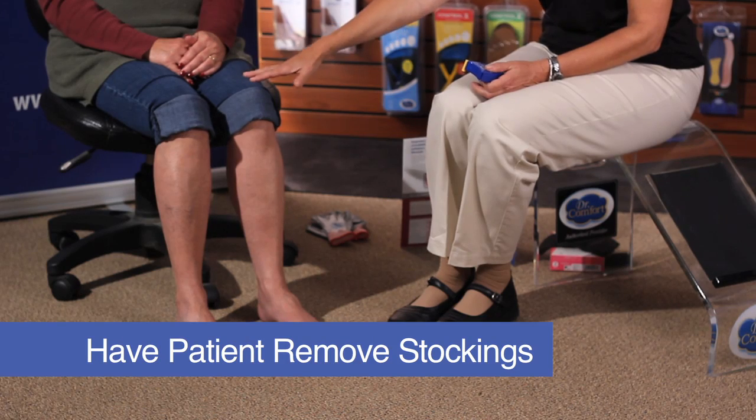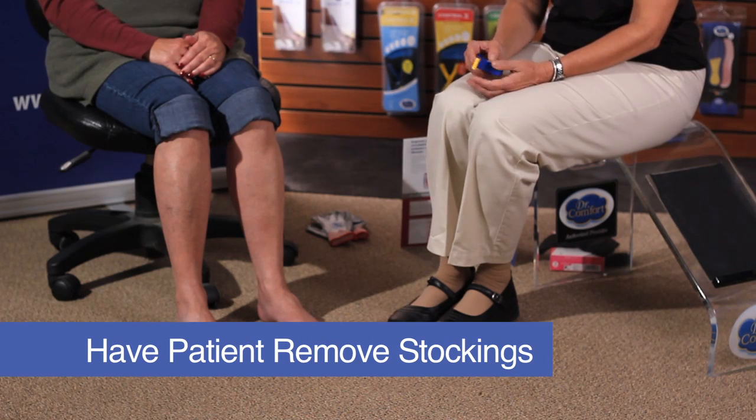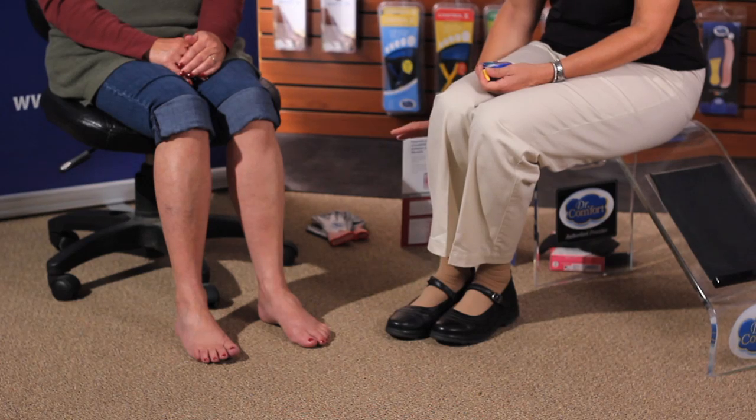The first thing you want to do is have the patient remove their stockings. Today, Kathleen is our model, and she does not have any ankle swelling, so it wouldn't matter what time we measure her. If someone does have ankle swelling, you may want to measure them first thing in the morning.